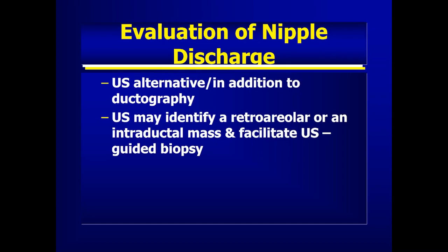And also, we can use ultrasound to help evaluate nipple discharge. Ultrasound can be used as an alternative or in addition to ductography. Ultrasound may identify a retroareolar or an intraductal mass and facilitate ultrasound-guided biopsy.